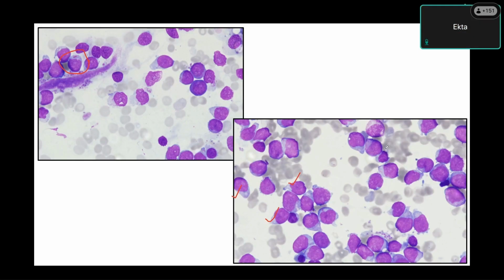So how do you? So now you think this is the acute leukemia. How do you classify acute leukemias, Jasleen? Acute leukemias are classified according to genetic or by differentiation. By differentiation, we have undifferentiated with minimal differentiation or with. So you're talking about AMLs, right? But before that, what do you have to do first? Sir, acute leukemias can be divided into AML or ALL with the help of MPO or PAS stain. Great. So MPO staining or PAS staining is something that you will do.